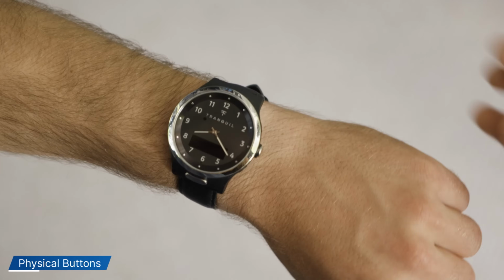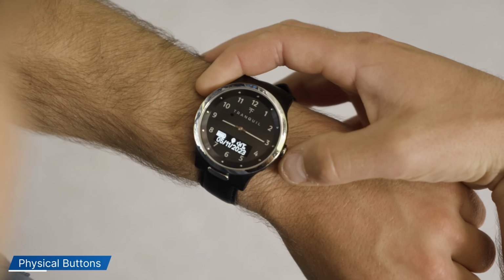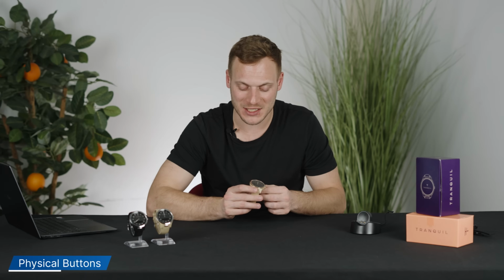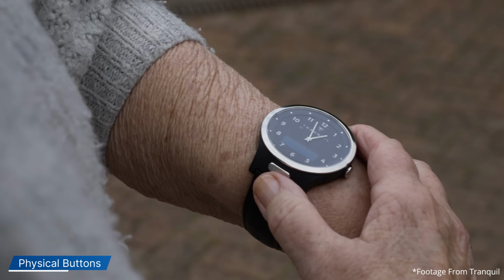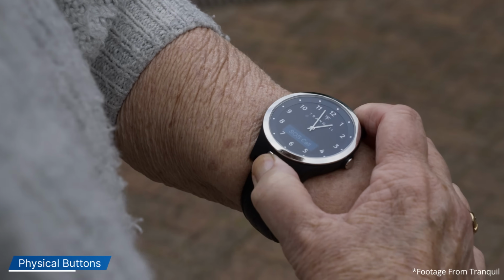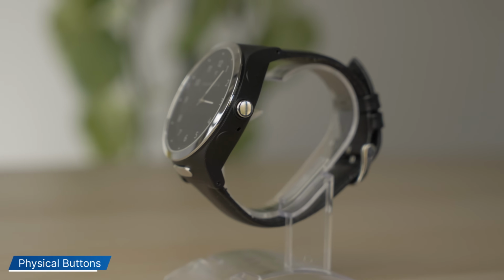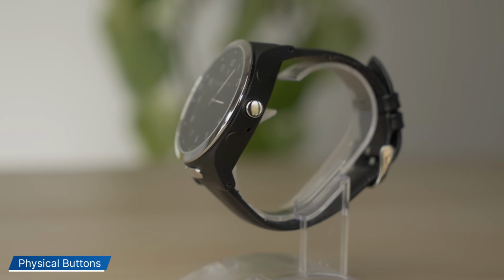So now we're going to talk about the buttons on the Tranquil Watch. Now, there's deliberately not many to keep it as simple as possible. The crown button on the side will bring up the battery life, the date, and the signal level, and the SOS button on the bottom here, when pressed and held, will make a SOS emergency phone call and send a notification to the smartphone app. And we're going to cover a little bit more about that in a moment.